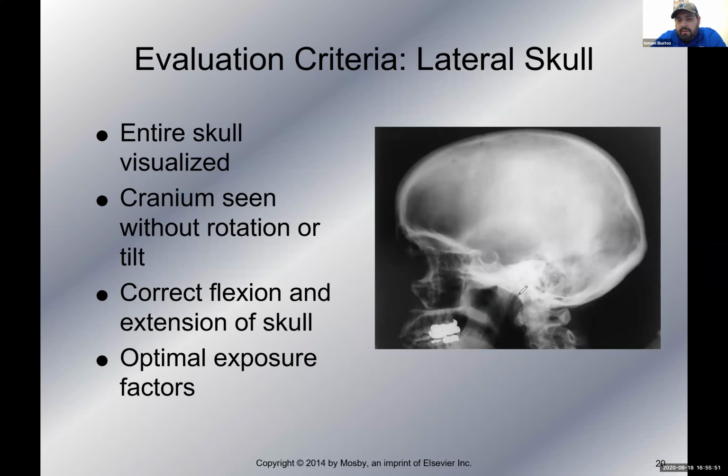All right, so again, mandibular rami, greater wings of the sphenoid, right? The other thing you can look at is the sella turcica, which is right there, okay? And if you see the dorsum sellae, which is the posterior part here, right? If you see two, because they're supposed to be superimposed like this. If you start to see one structure in front of the other, then you have some rotation. And the last thing would be the EAMs, which would normally be about right there. And you'll see two holes there. If you start to see one hole in front of the other, then that means you have rotation. Okay, so those four structures, mandibular rami, greater wings of the sphenoid, sella turcica, EAMs.